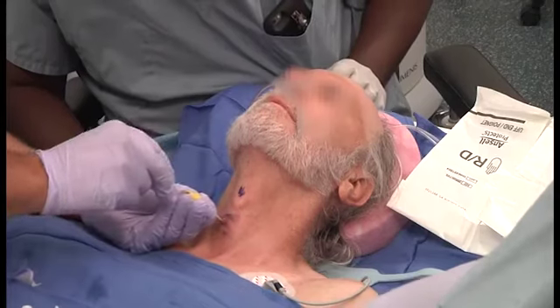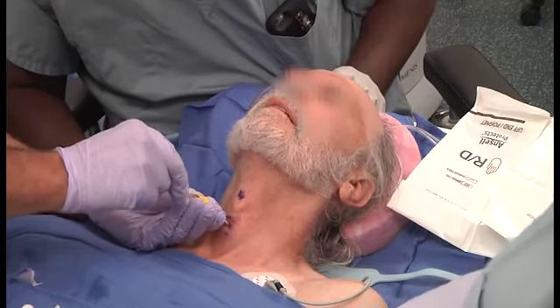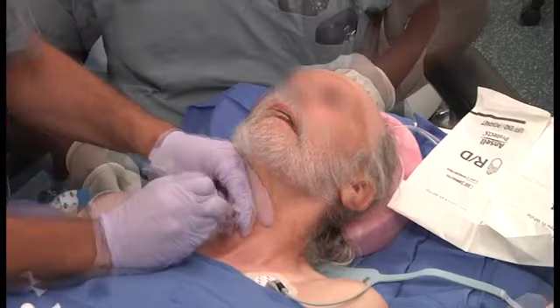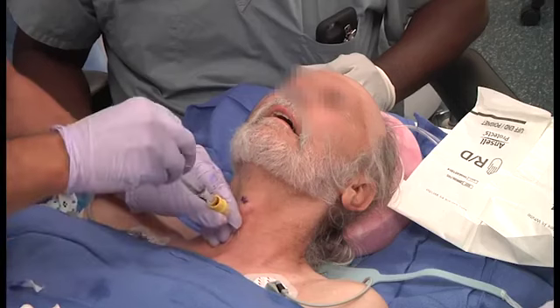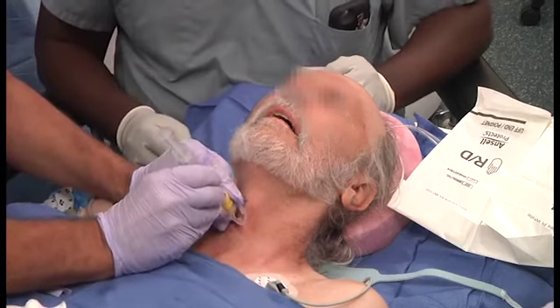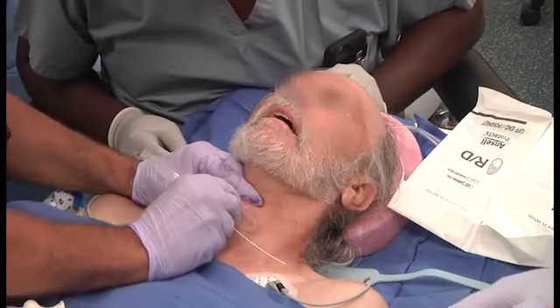A 14-gauge Ravussin needle was inserted through the cricothyroid membrane under constant air aspiration. Once air was aspirated from the larynx, the plastic catheter of the Ravussin needle was advanced.